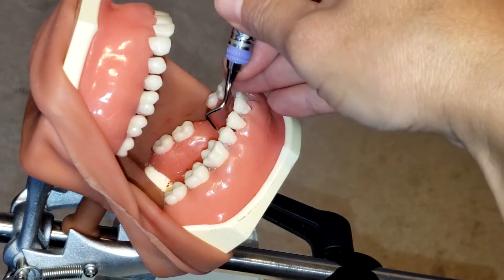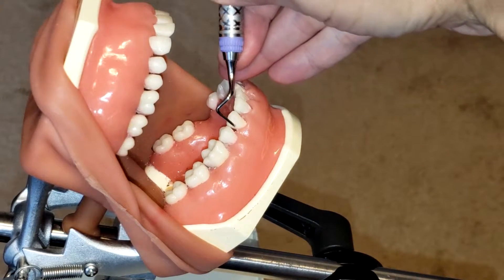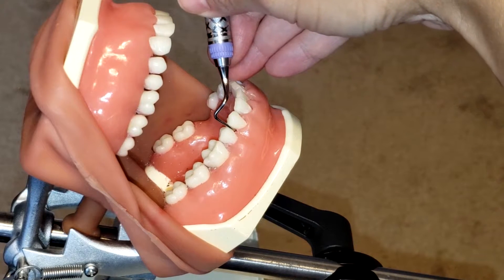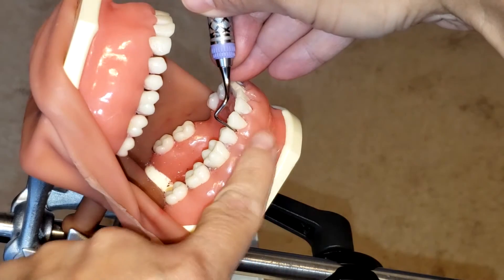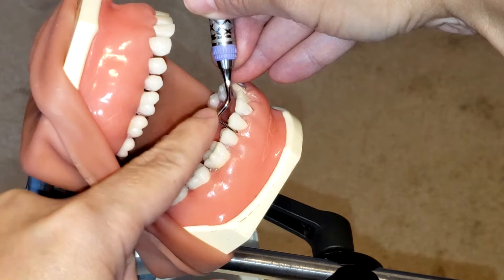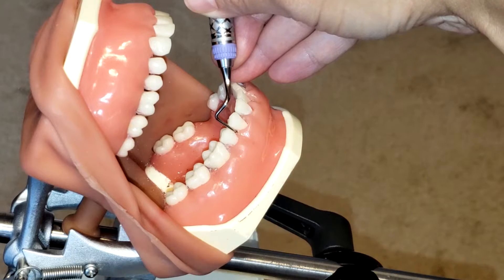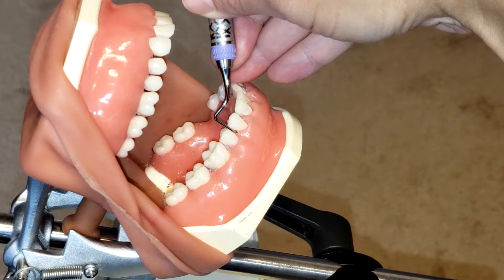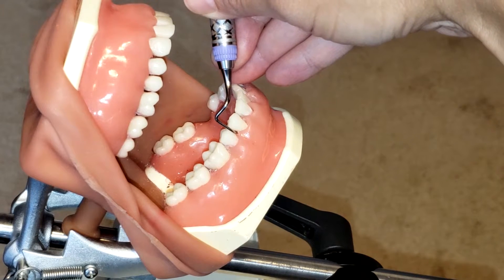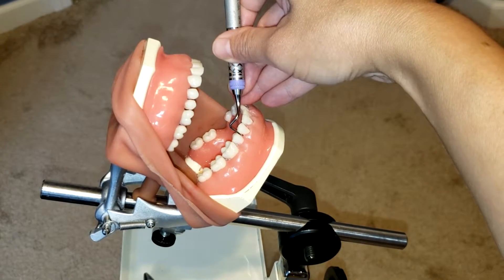Now let's get to it. With this instrument you want to make sure that you are establishing the correct working end. To do so, you will start by placing the instrument between the two premolars — you can use that as your guide. You'll see that the lower shank is parallel to the long axis of the tooth, but it creates a right angle on the distal aspect of the first premolar. That is how you know that is the correct working end, with the handle outward.